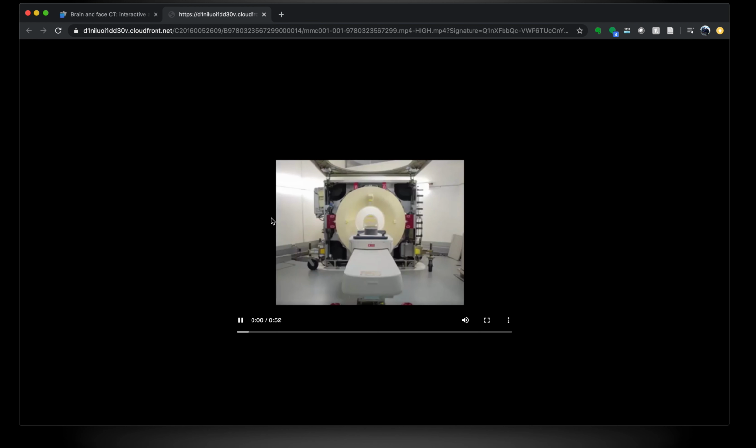We're going to watch a quick video on what a CT gantry actually looks like. Here you can see this large setup. Here's the bed that the patient would be lying on. This is the little donut hole where they pass through. What's spinning right here is the X-ray beam and the detector array within the gantry. Again, you can get a sense of how this spins around the patient. The patient would be right through here and would move through the CT gantry. As it goes, you're getting a large number of images during that process.